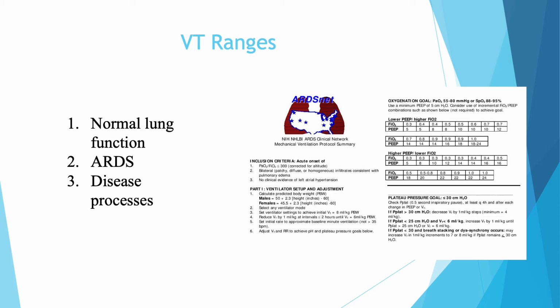it is very important to follow ARDSNet protocol, which I've displayed on screen here, that recommends PEEP values based upon the FiO2 that's being delivered, or oxygen, and using low tidal volumes, usually 4 to 6 milliliters per kilogram of ideal body weight, to reduce volutrauma and barotrauma in the patient.